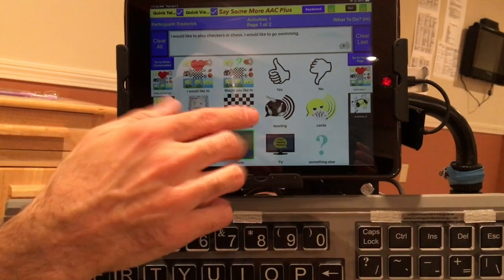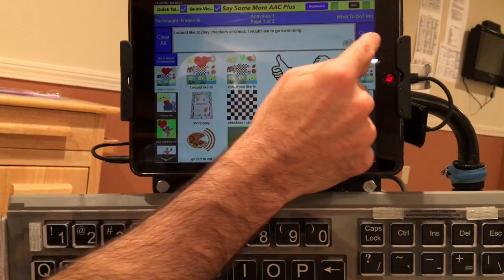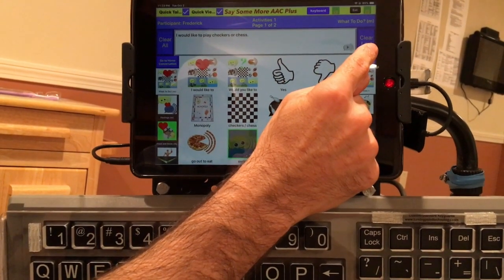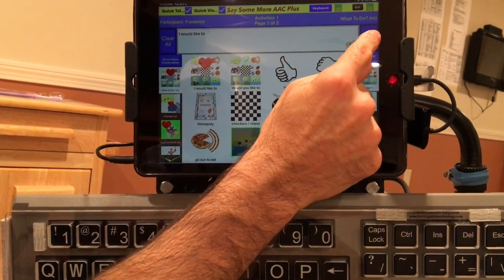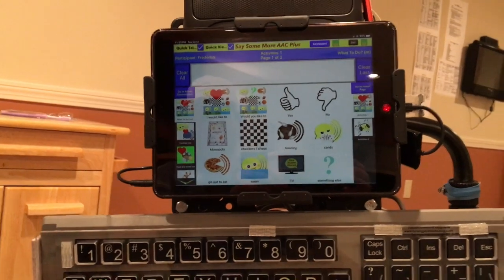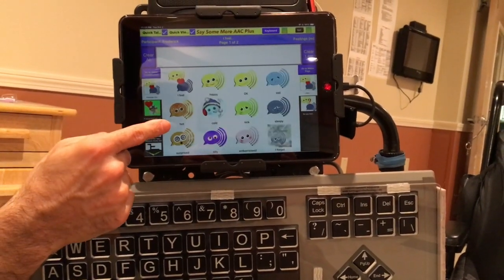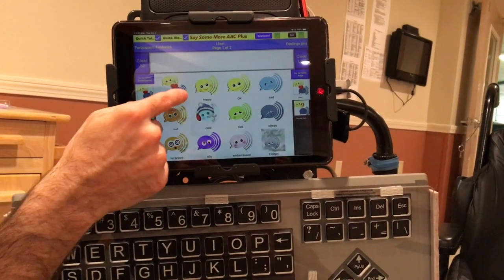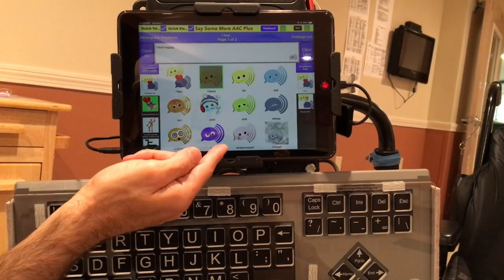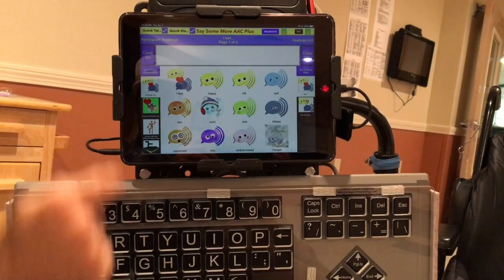If you want to clear the log of the conversation you're making, there's a Clear All button here. There's also a Clear Last. Clear Last is like a big backspace button. It removes each of the conversation snippets. And if you press Clear All, it gets rid of all of them. So yeah, and then if you want to switch conversations, again, you just press the new conversation, feelings. I feel happy. And you can say it again. I feel happy. Clear. Okay.